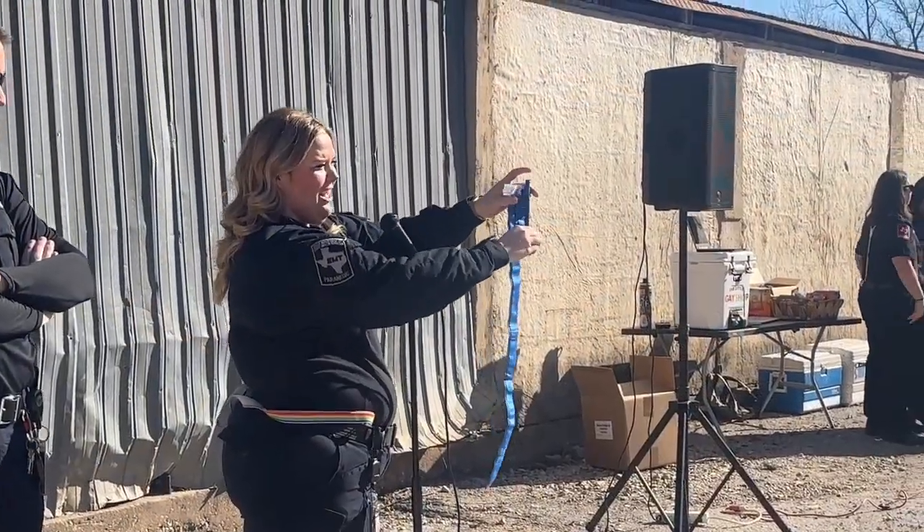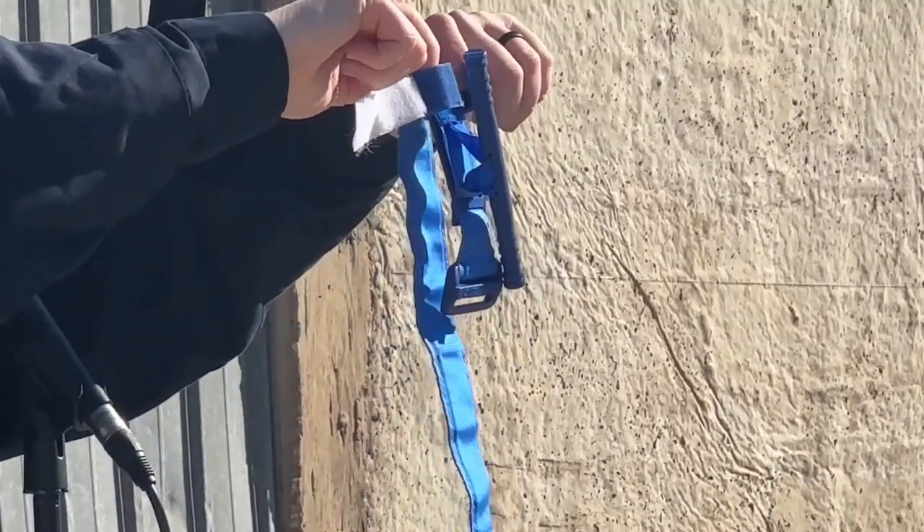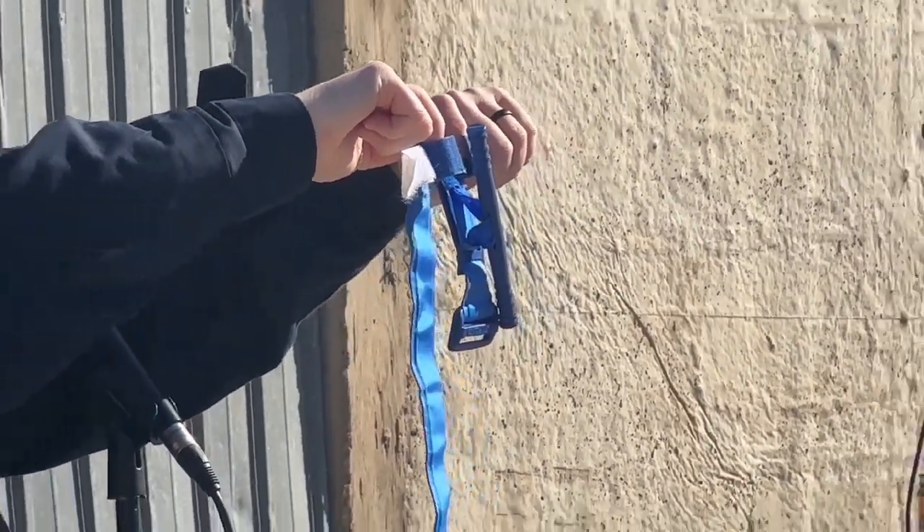This bar here is your windlass, and then these two things at the top where the bar sits is the windlass clip.